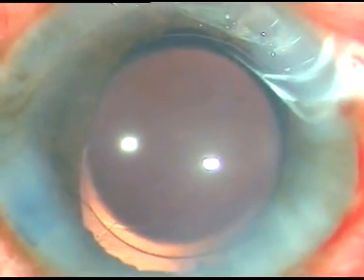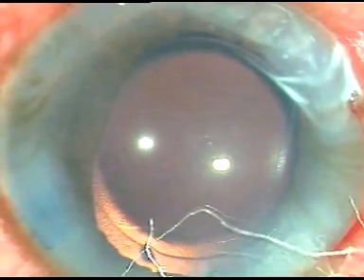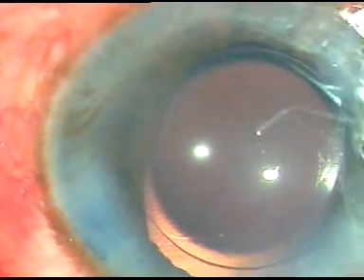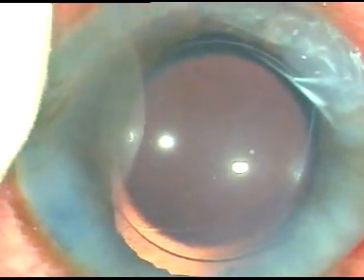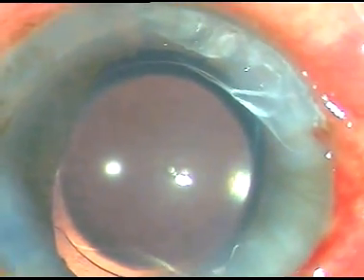So the antechamber has been formed. I'm checking if there is any leakage or not. There is no leakage. Now I check the intraocular pressure. It is fine. And now I inject a little bit of dexamethasone and conclude the case.